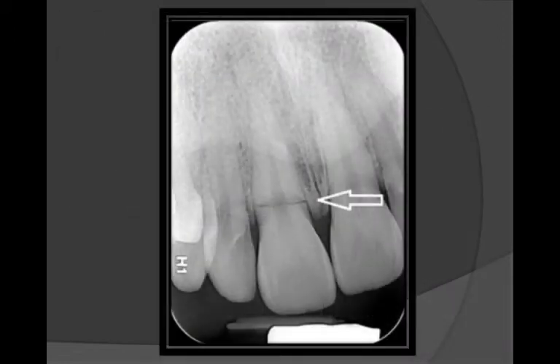Dentoalveolar fracture. In this case clinically the tooth was mobile, tender to palpation and percussion, and non-responsive to cold test. The radiograph we took shows a horizontal line in the cervical third of the root of the tooth, we see it in this image.